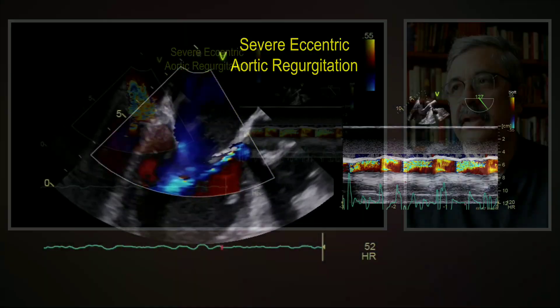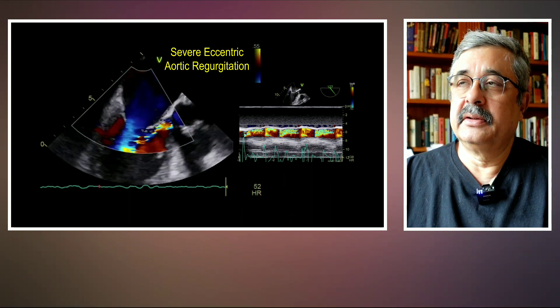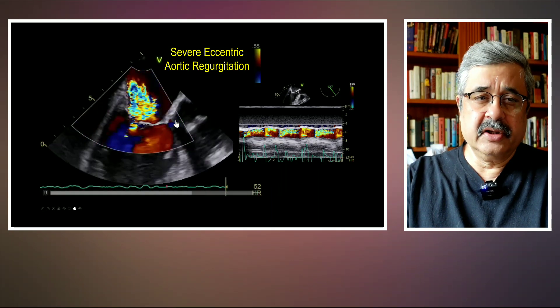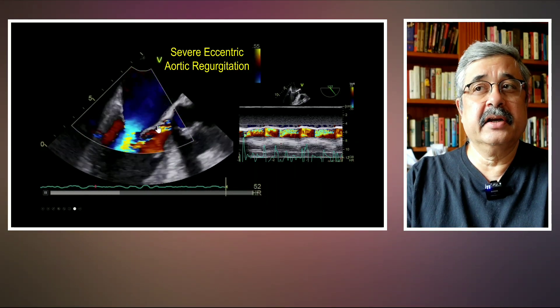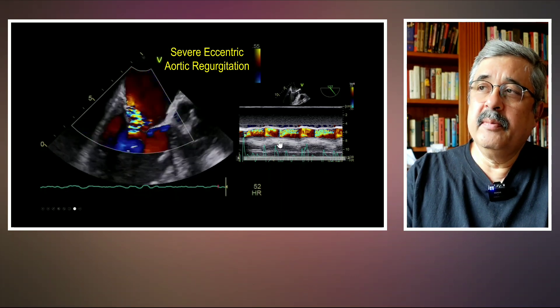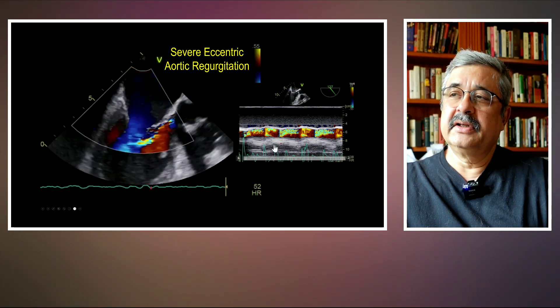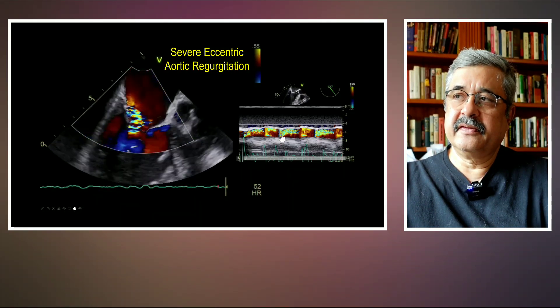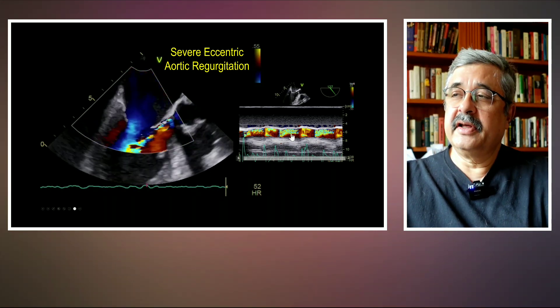The diagnosis in this specific case is severe eccentric aortic regurgitation. As you can see in the mid-esophageal long axis view, this is the aortic insufficiency jet, which is eccentric and directed anteriorly, hugging or striking the anterior mitral leaflet. This is very obvious on the M-mode through the LVOT with color flow Doppler. This is the aortic ejection phase, and this is a holodiastolic regurgitation which fills more than 50% of the LVOT.